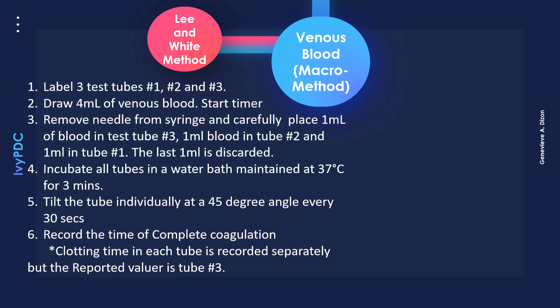For the Lee and White procedure, label test tubes number one, number two, and number three. Draw four ml of whole blood and start the timer. Remove the needle from the syringe and transfer one ml of blood to test tube number three, then one ml to test tube number two, and lastly one ml to test tube number one. The last one ml is discarded together with the syringe.